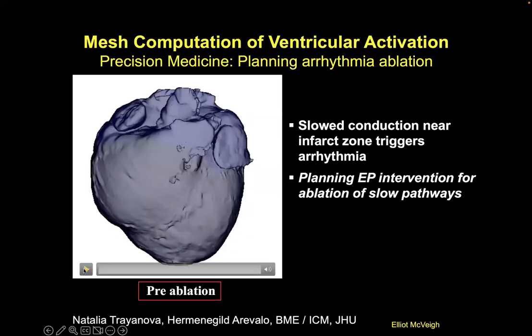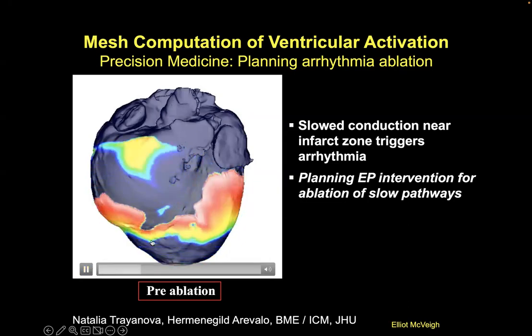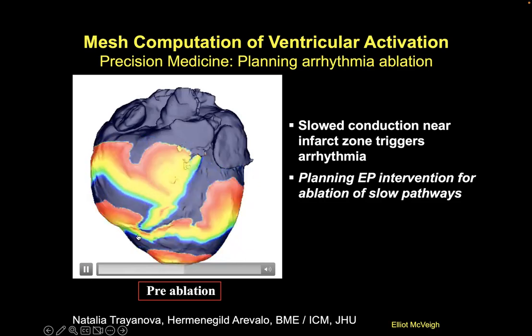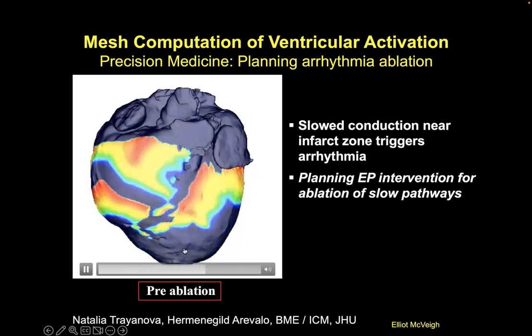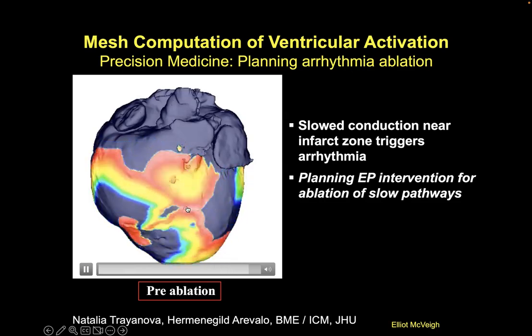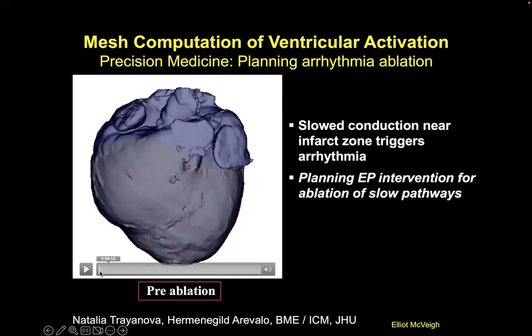What we did here, did I show this? This is when you measure where an infarct is. So we have, in this 3D, with this patient with MR, essentially a picture of where the infarct is in the three-dimensional structure of the myocardium. And then this simulation is an electrical simulation in which you pace the heart from the apex here. So we're going to give one pacing pulse.